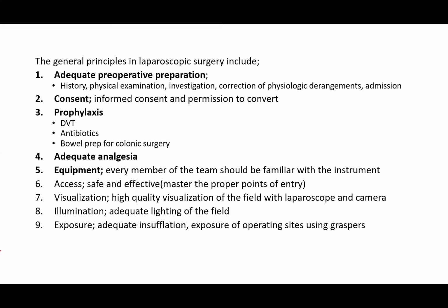Now, the general principles in laparoscopic surgery are the principles to follow when you are preparing a patient for laparoscopic surgery. When you say principles, they are those measures you take in the preoperative, intraoperative, and postoperative period to achieve a better and successful outcome.